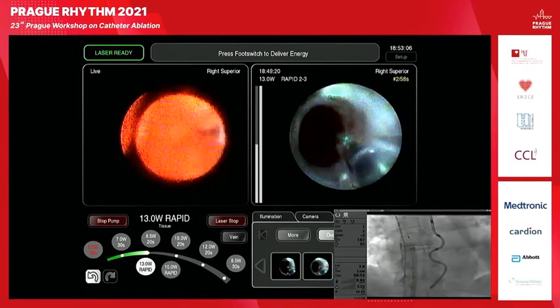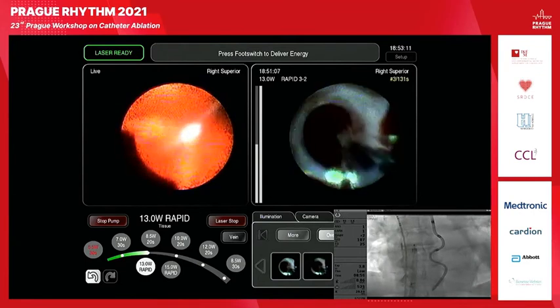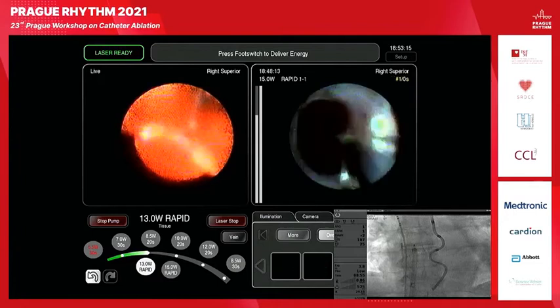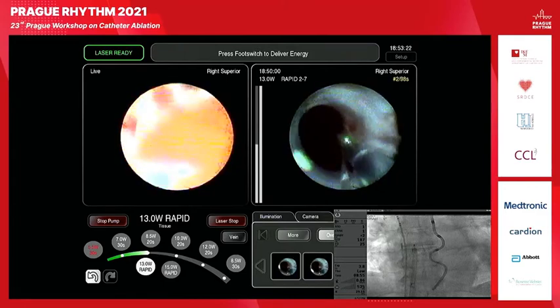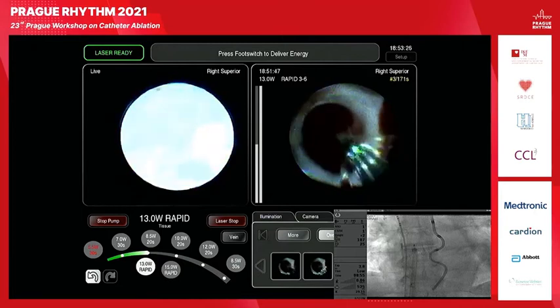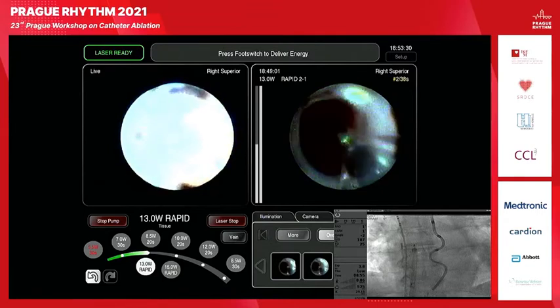So what I like to do, because it's a little bit safer, is I really want to suck from the shaft and from the sheath back. Okay, don't do it too fast. Okay, be careful. We need to be careful about air embolization. So it's exactly what Peter Peichel said about all these big sheaths.